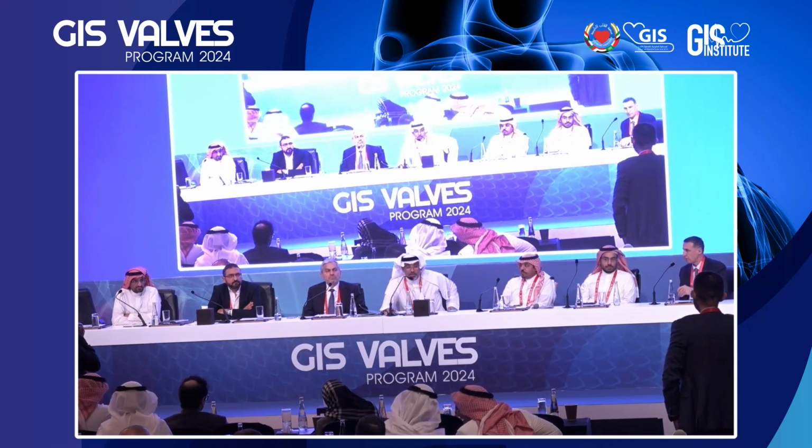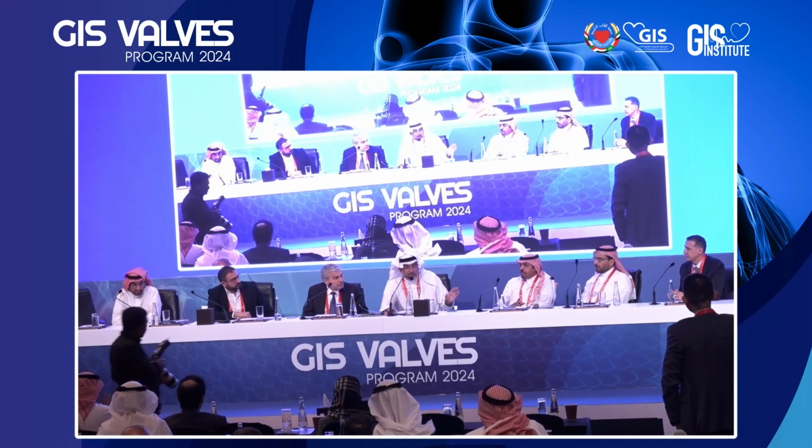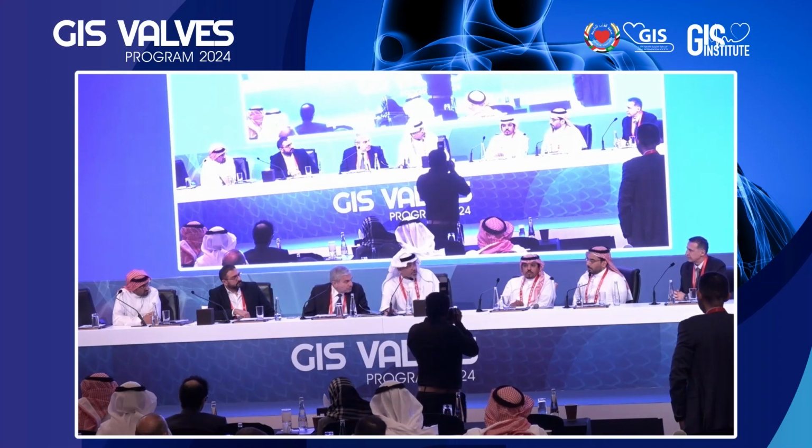While we are getting the team back, I think we have a question from the floor, but let me direct this very important question to Dr. Anas. We see this report of paradoxically low gradient severe aortic stenosis. What are the echo parameters? I know Dr. Razal went over some of them, but as an echo lab, do you usually ensure that when you supply us with the measurement, you have already excluded all the technical aspects of diagnosing a paradoxically low gradient aortic stenosis?